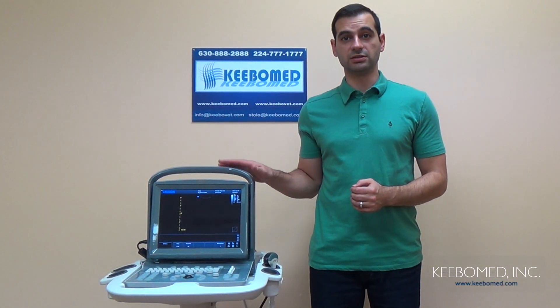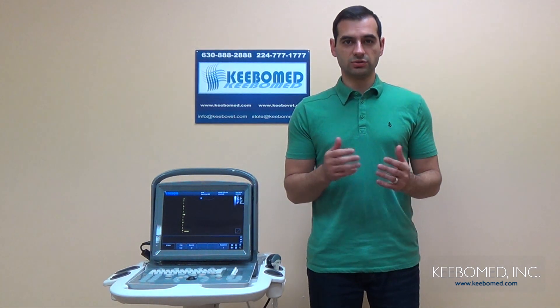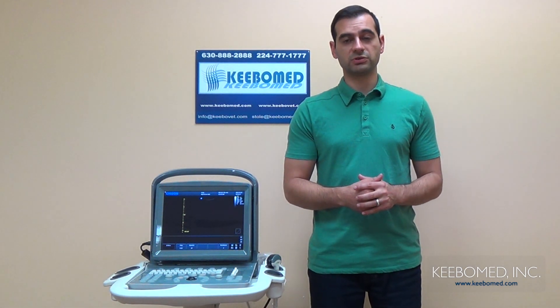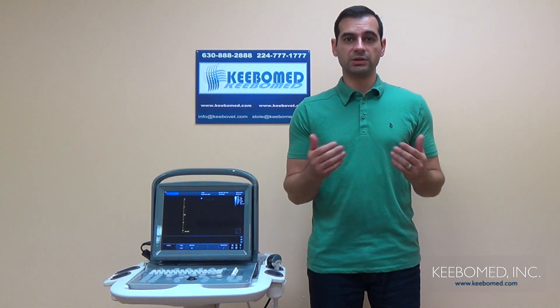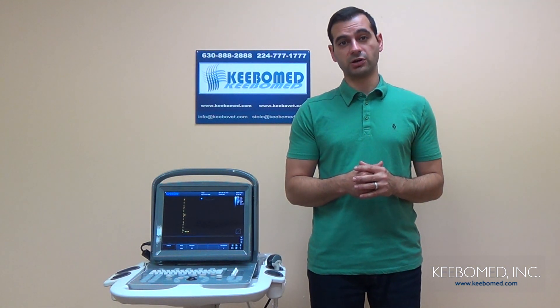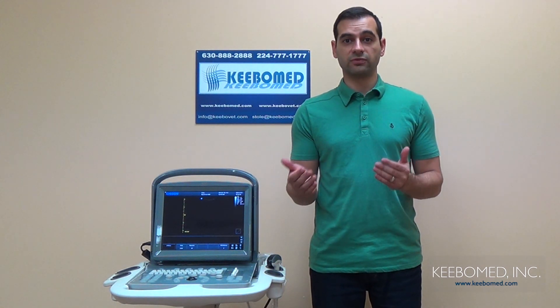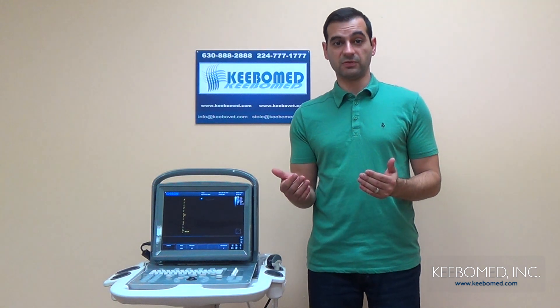Hi, my name is Timothy from KiboMed and this is the Chison Eco1 Black and White Human Ultrasound. Choosing the right ultrasound is one of the most important decisions you can make for your practice. With so many different options, it can be difficult to choose the proper one. Well, the Eco1 is one of the most affordable ultrasounds on the market today, yet it has features that are found in more expensive machines.